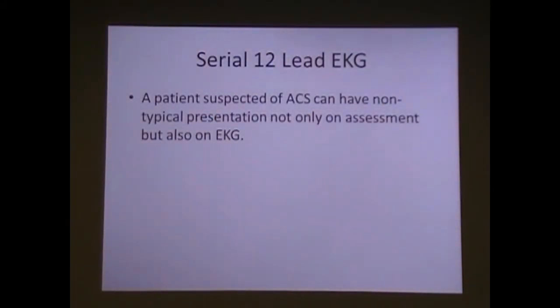Serial 12 lead EKGs. They're hugely important. If I'm doing a flight, say from Truckee to Reno, I've probably done a minimum of 1 on scene or at the hospital and 2 in flight. And I want to be able to show that progression. If I'm going to Renown, I'm going to Carson, wherever, I want to be able to show the serials, because that's hugely important to the cardiologist. One is to see if my intervention would have been effective.